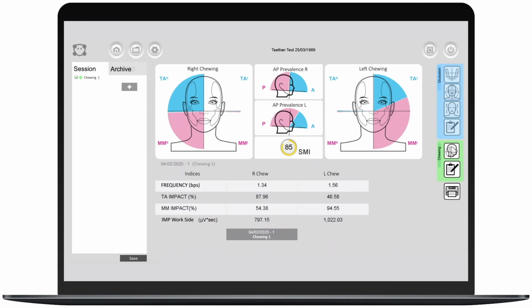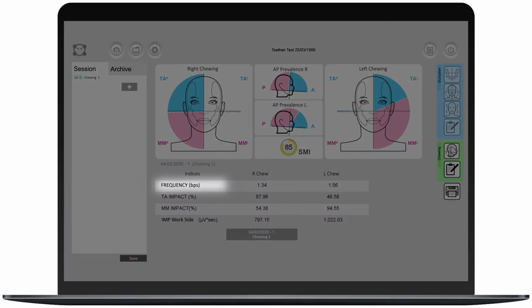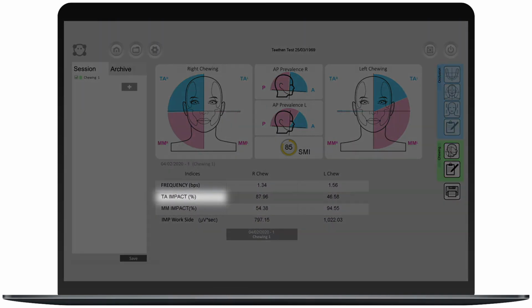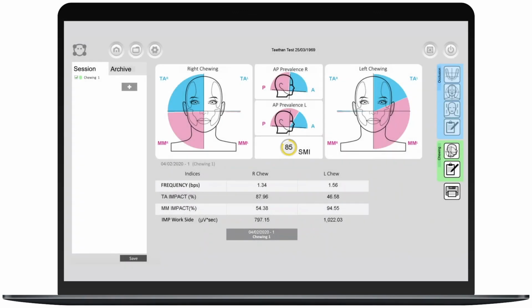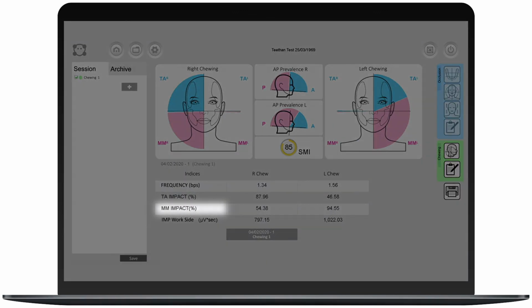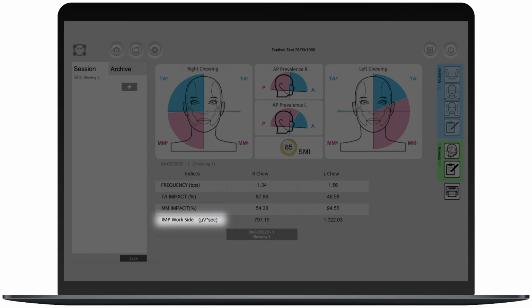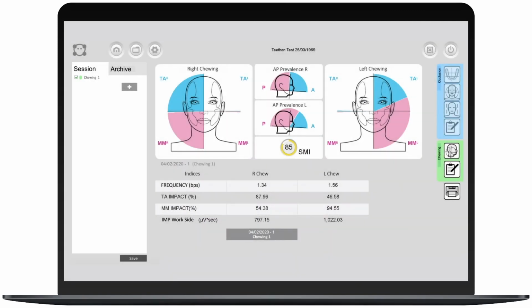In addition to the graphical representation, some numerical indices are calculated for the right and left side. The frequency represents the number of chewing cycles per second. TA impact is an index of the muscular work produced by the temporalis anterior muscles during the test. MM impact is an index of the muscular work produced by the masseter muscles during the test. And impact of the working side is the non-normalized muscular work of the right and left side during the execution of the test.